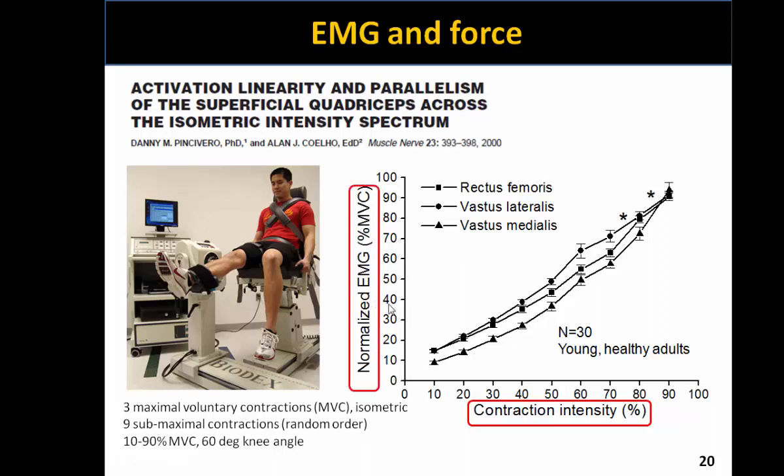Likewise, the sampled EMG data were quantified and normalized to the EMG bursts quantified during the 100% MVC, which would then yield a unit in percent.